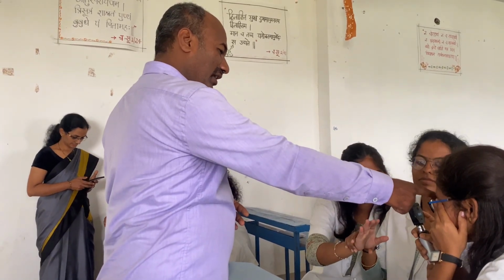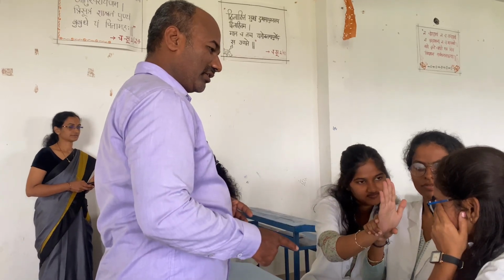The viewing window should align with your pupillary axis, visual axis.